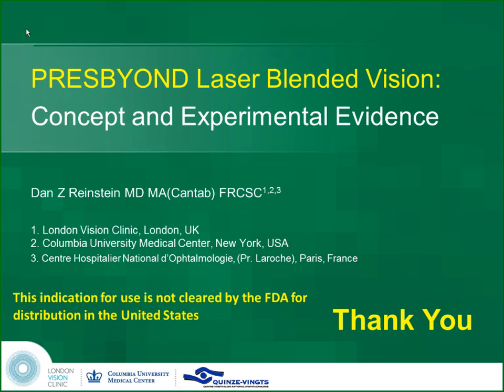In contrast, the control group, who had no night vision disturbances after their LASIK for the same amount of preoperative myopia correction, we increased their spherical aberration, but their contrast sensitivity ratio did not change. And so this told us that it is healthy to have a certain amount of spherical aberration in the eye. And that level, we empirically from this study realized was somewhere around the 0.56, 0.6 micron level.